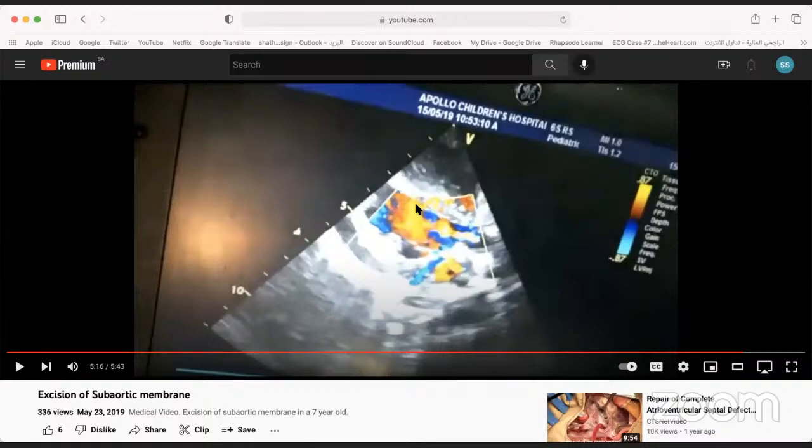If you use the snares, what will happen to the cardioplegia that you're injecting into the patient's root at the time of giving the cardioplegia? Where would it go? If we use the snare, it will go to the coronary sinus. And then? To the right atrium. How much volume do you give for cardioplegia? Well, for pediatric, I don't know actually. But for adult? I don't have the exact formula. Approximate? 25 ml. 250, maybe. Okay, we usually give quite a bit.